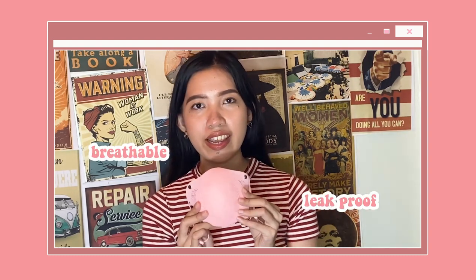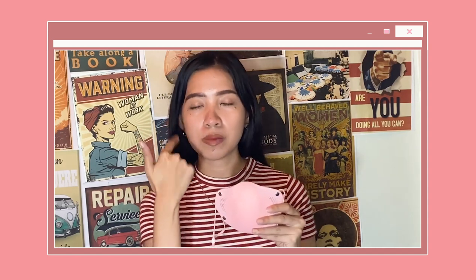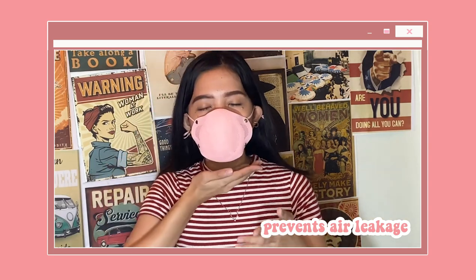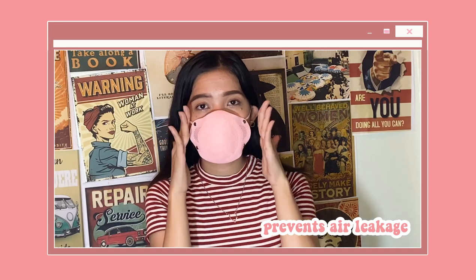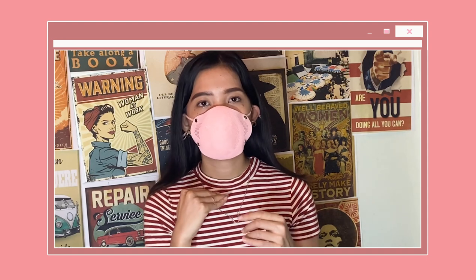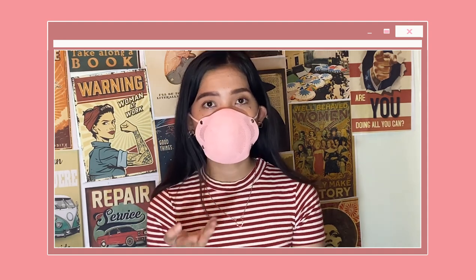It is breathable and claims to be leak-proof. Unlike the regular surgical mask or the regular KN95, it leaves some space on the sides. The two gaskets set the filter and create the skeleton that makes it fit perfectly on the face, and it also prevents air leakage. Testing it out, it does not have any air leakage from the sides or that area — there is only minimal air leakage below the chin. It is breathable and I can also speak well through it.